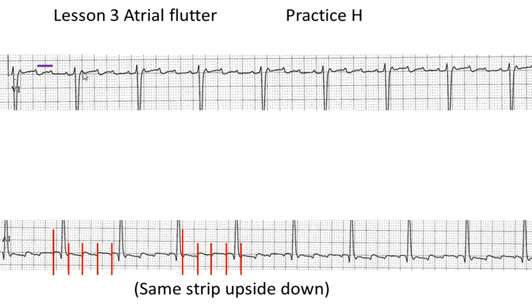If you look at this strip up here, we see regular occurring bumps which honestly look a lot like P waves. But if you look at the rate between these bumps, there's about six little boxes between, which would give us a rate of close to 250 beats per minute — absolutely impossible for a P wave to go through the AV node that fast.